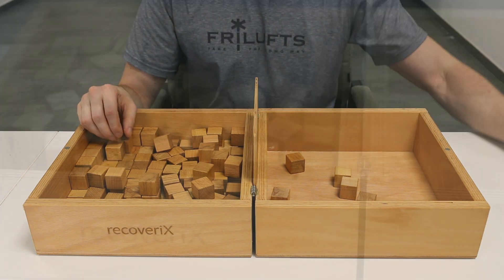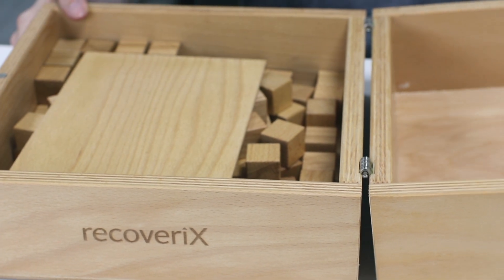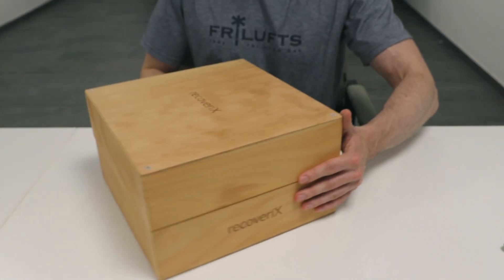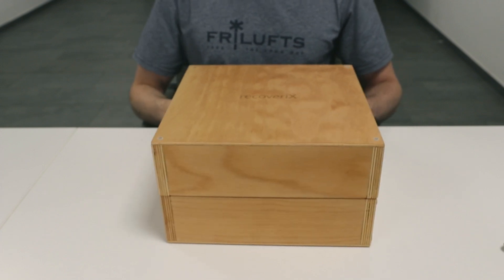Finally, scores obtained from these modified versions should never be compared to the standardized Box and Block Test, as they were obtained under vastly different conditions. Our Box and Block Test is available on Amazon — go check it out if you are interested in buying our handcrafted, premium quality Box and Block Test.